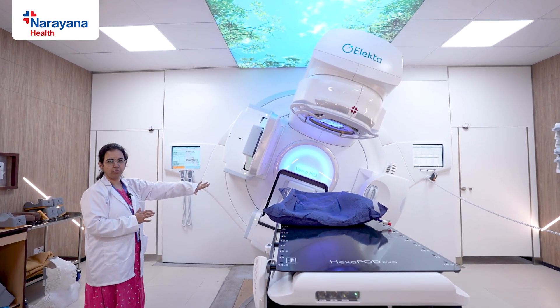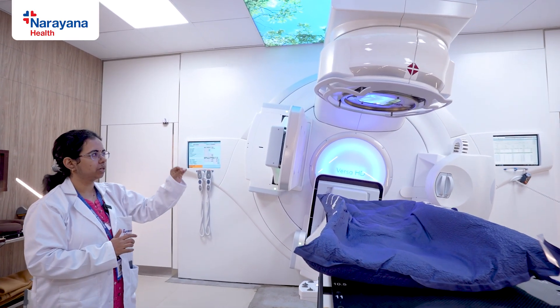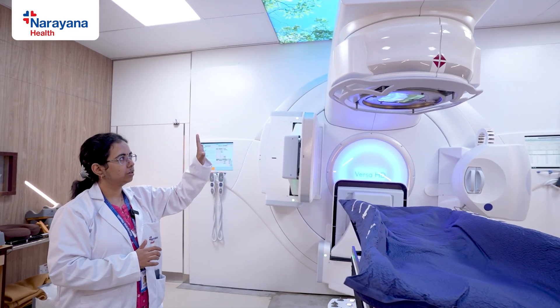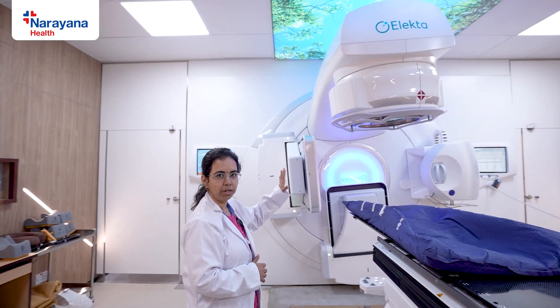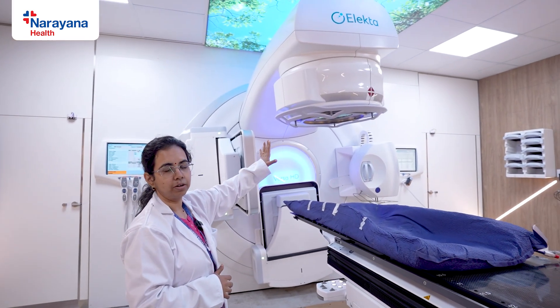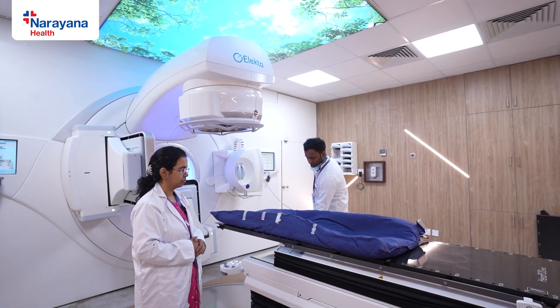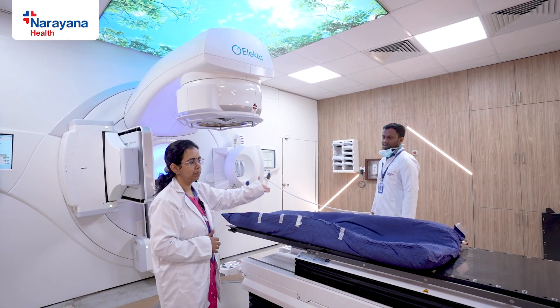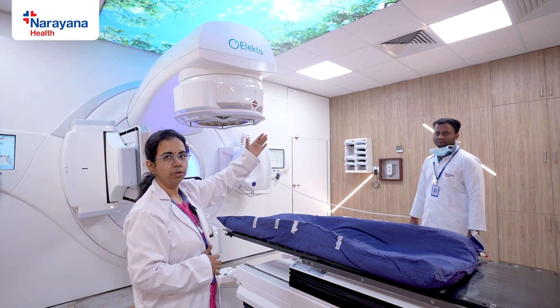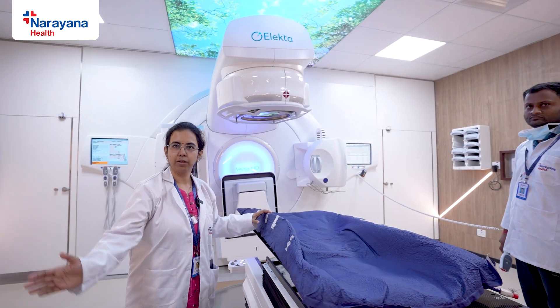The patient is lying well below and the gantry head is not going to touch her. Even if something comes in its way, the treatment stops immediately. Once treatment is done, the gantry returns to its normal position and the couch is moved out from the gantry so the patient can get up without colliding with the head. She is then free to walk and go back.